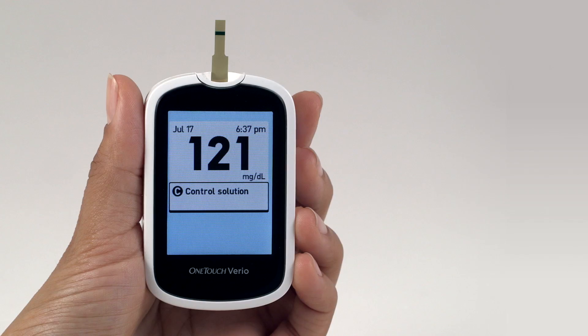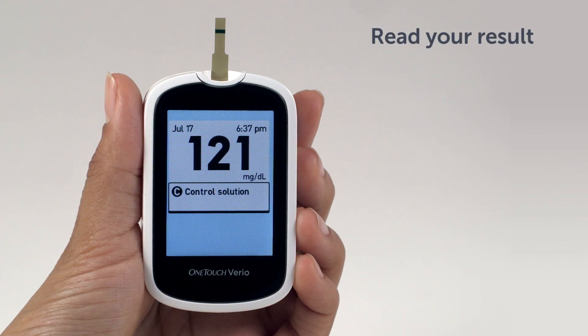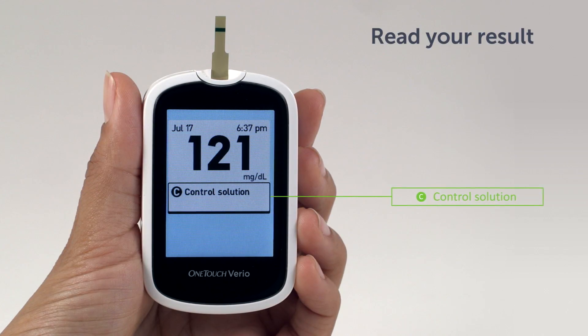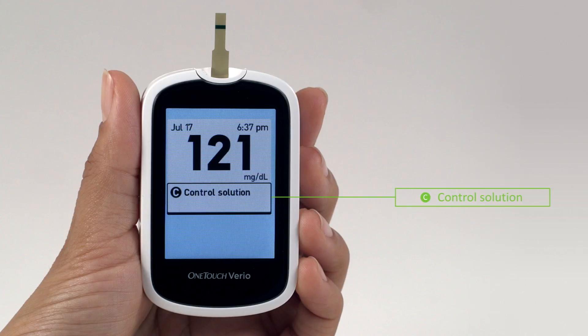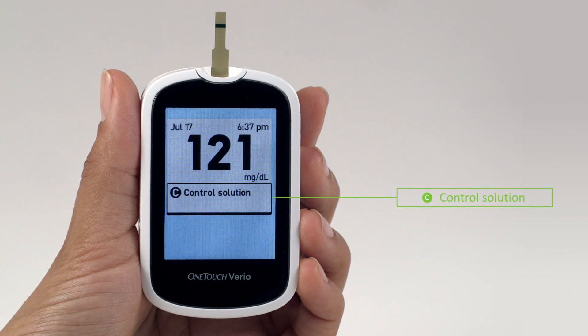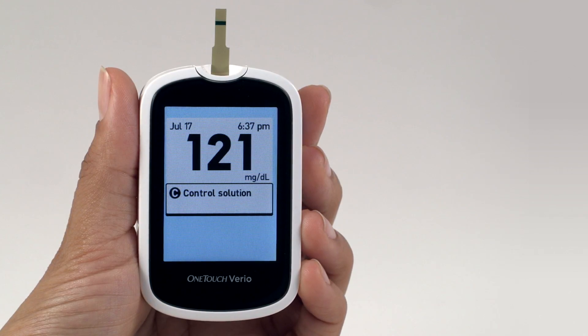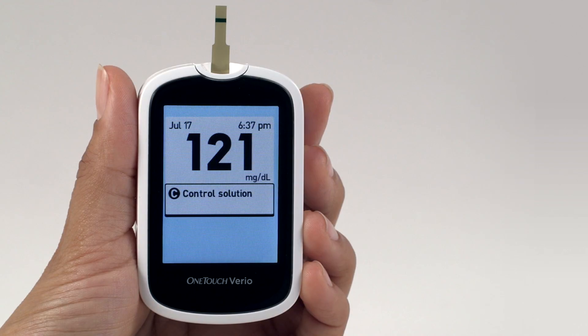Here's an example of what your result could look like. Your result is displayed along with the date, time, unit of measure, and the letter C for Control Solution. The meter automatically marks the result as a Control Solution test. Control Solution results can be seen when reviewing past results but are not included in result averages. If the words Control Solution do not appear on the screen, this result will be included in your averages and your averages will change. Repeat the test with a new test strip. If the problem persists, contact customer service.